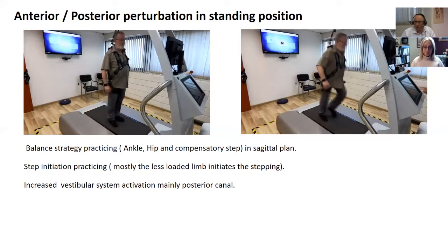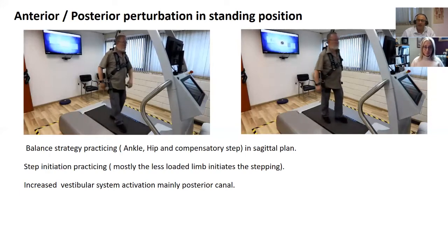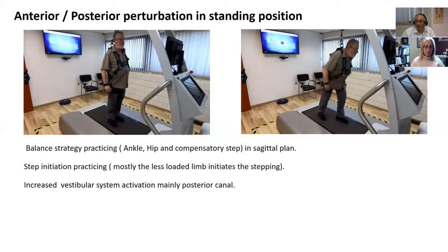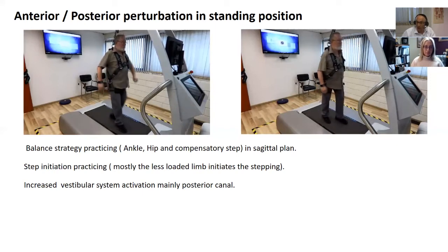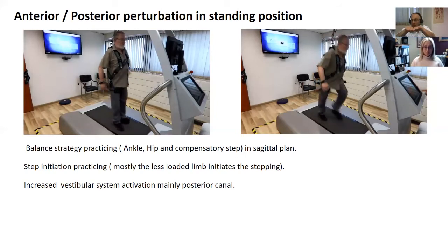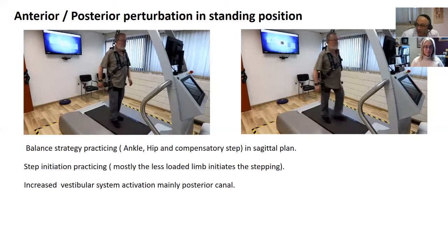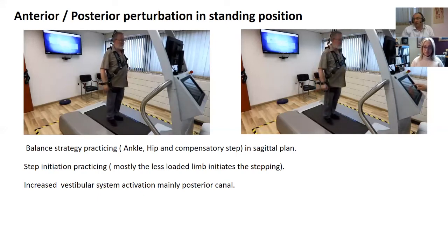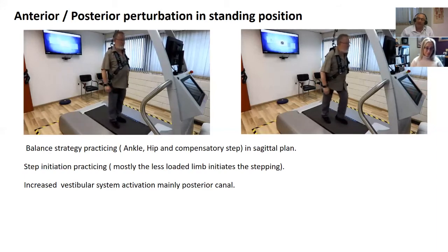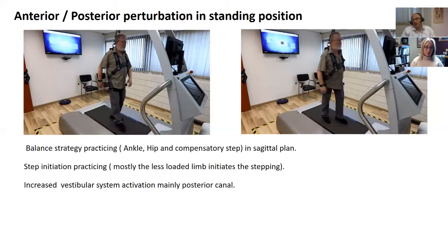As I said before in some of the earlier slides, if you decrease the intensity of perturbation, it might very well be that his reactive response, that ankle flexion, may be enough to set up a reactive ground force to push that center of mass forward back within his original base of support, which is that double foot stance. Yeah. But as you increase that intensity of perturbation, then he's really going to take that step backwards.